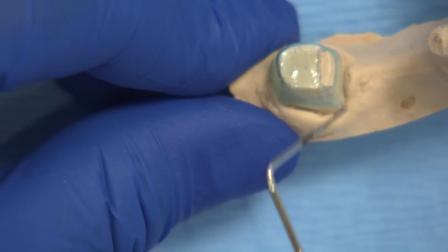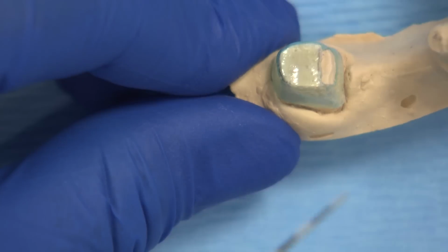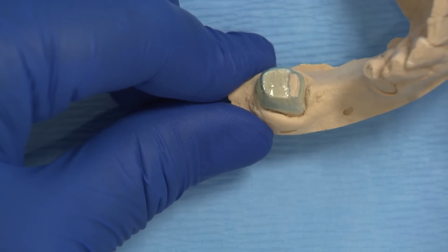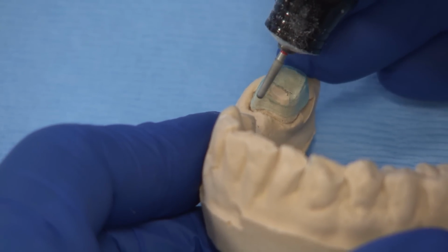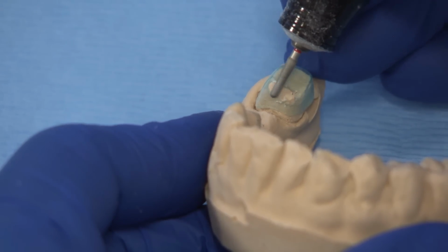Here is a plastic coping that indicates where the undercut is and is translucent so you can see the tooth through it. When seated on the solid model, we can easily see the under-prepared area sticking out of the opening. This amount of the tooth structure needs to be removed to match the plastic reduction coping provided by the lab. For this case, the exact amount of 0.8 millimeter is indicated by the software, and the way we do this is by taking the coping in the mouth, putting it down on the prep and adjusting the tooth structure sticking out of this window until the 0.8 millimeter undercut is removed.